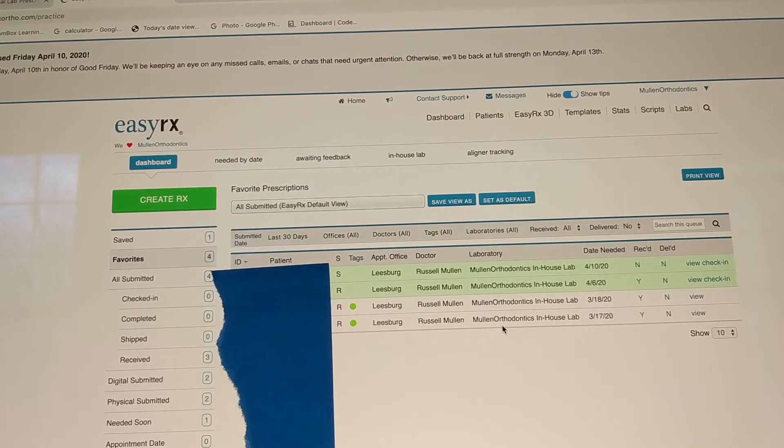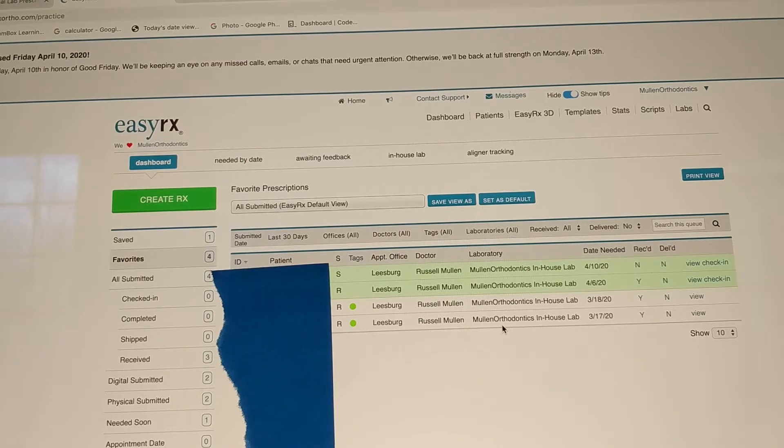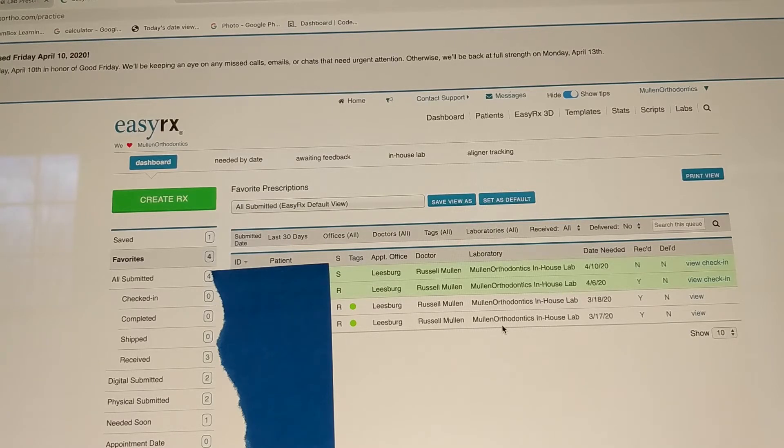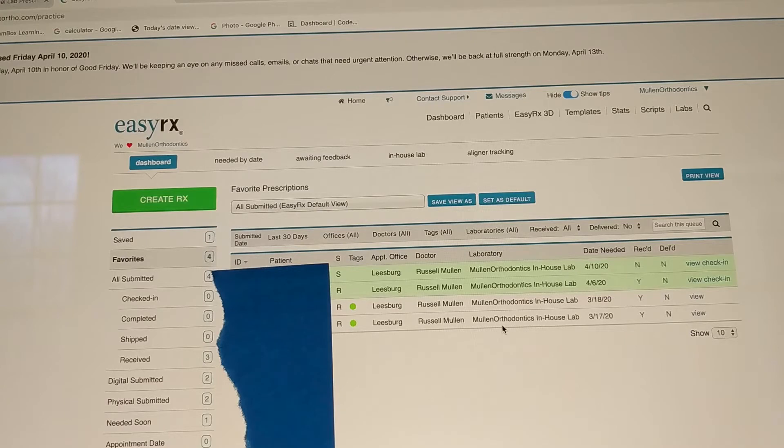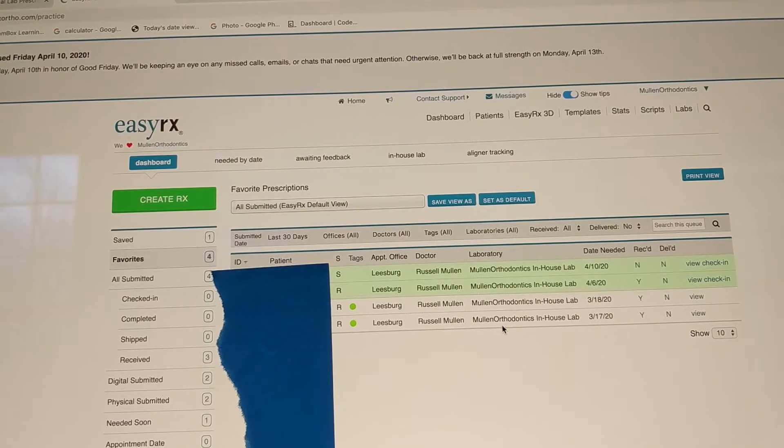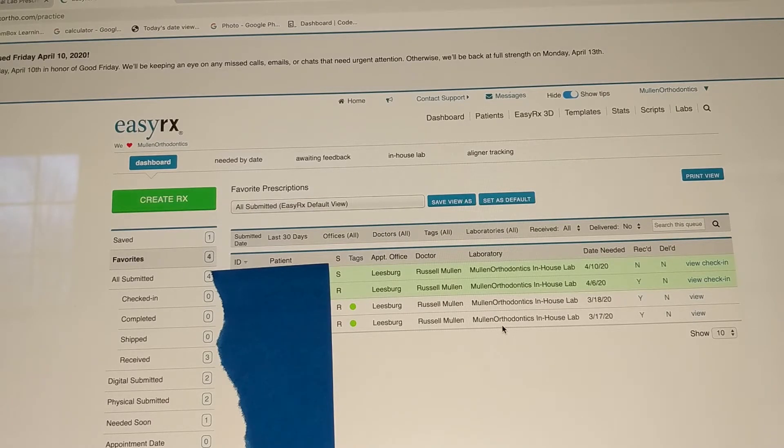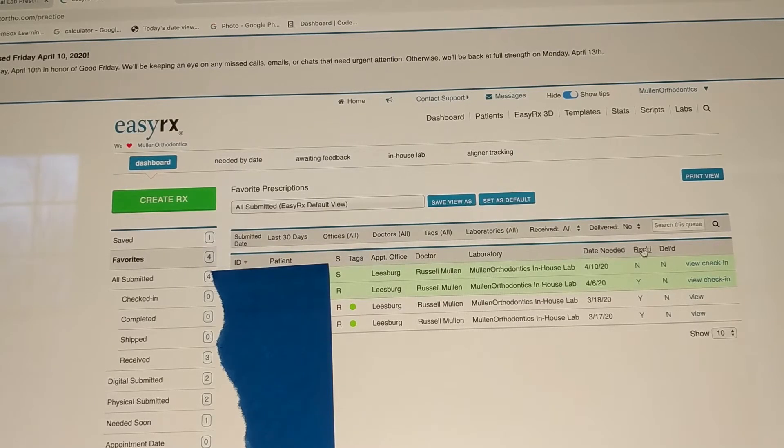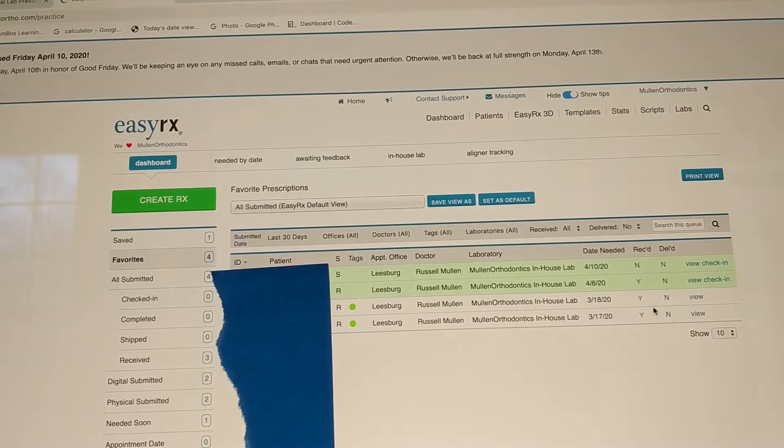So this is where all of these happen to be Mullin Orthodontics in-house lab. But we use a bunch of other labs, which is very easy to link up with EZRX. So for instance, Acutech, AOA, our local lab is also on here. It's kind of a one-man show. Shannon is awesome. But he uses it too. So quite a few people use EZRX. It's a very popular platform. And then just these are some tags, whether the appliance has been received and whether it's been delivered to the patient.